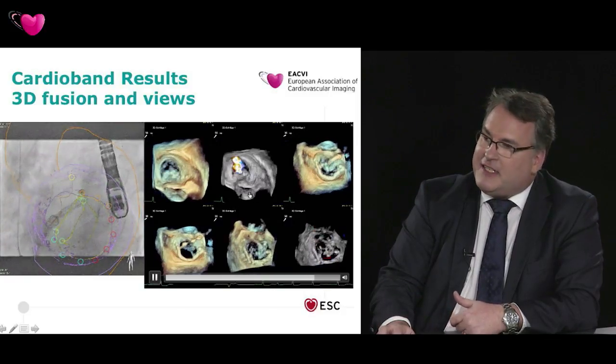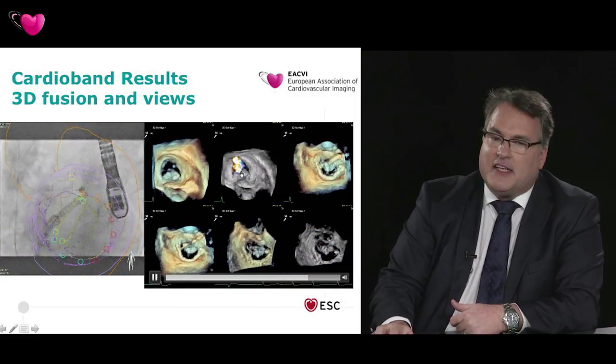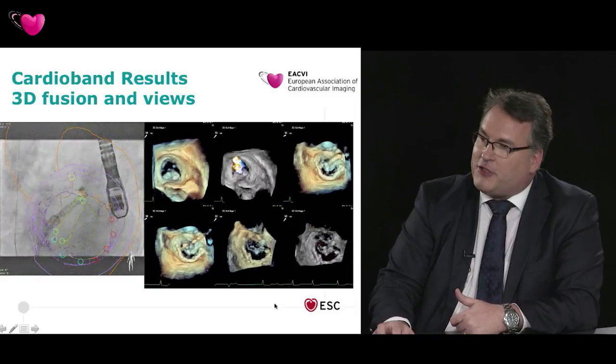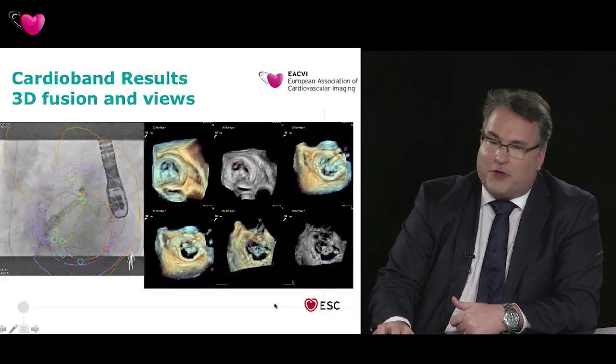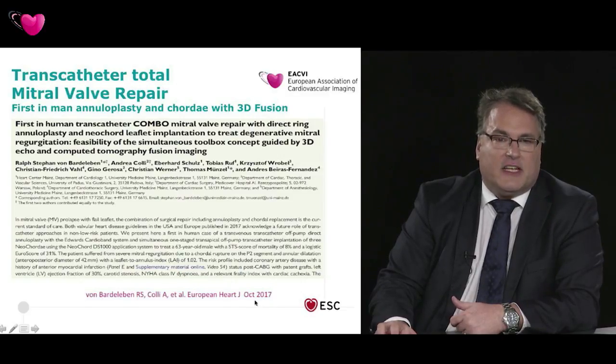And within 60 to 90 minutes, you come from this hemodynamic state to this hemodynamic state. And this is sometimes a reduction in LA pressure of 20 millimeters of mercury. So very, very dramatic. And we've shown this here in the European Heart Journal in October 2017.